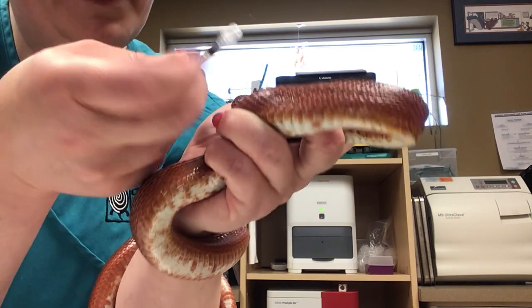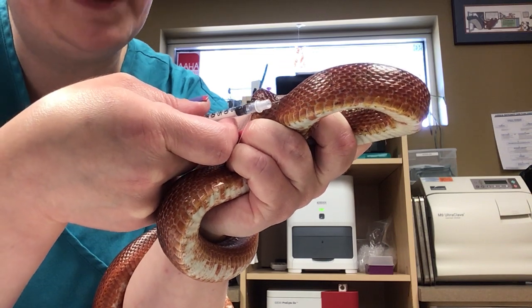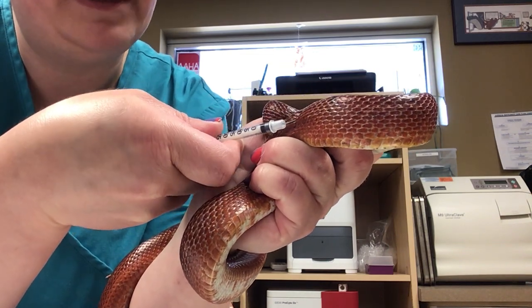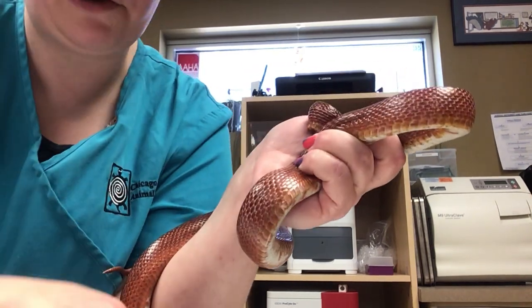Sometimes that might happen — so if it does, just find another spot and do it again. I'm going to go a little faster this time: pull back and then plunge in. And then just give it a little rub. It's like getting a flu shot — if you rub that muscle out, it'll feel a lot better.